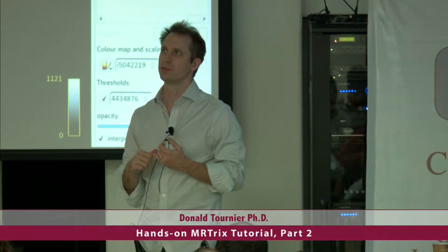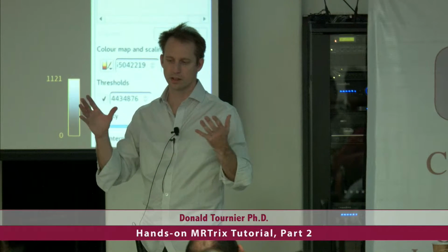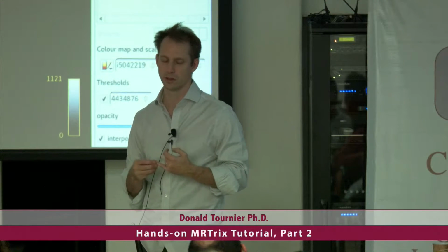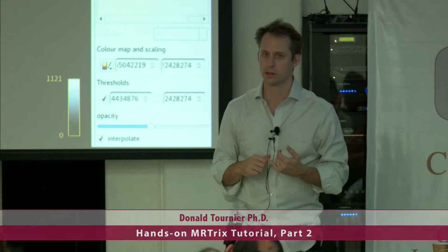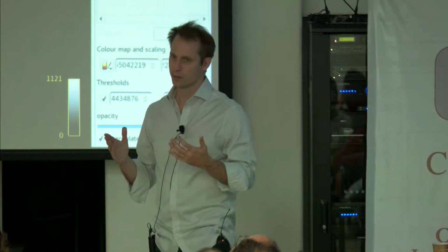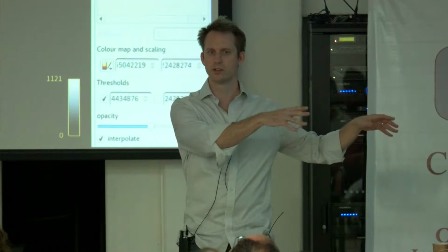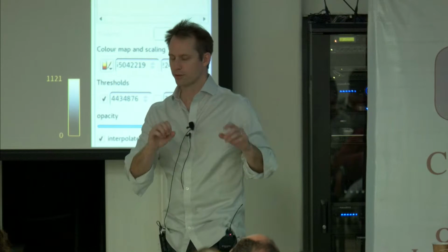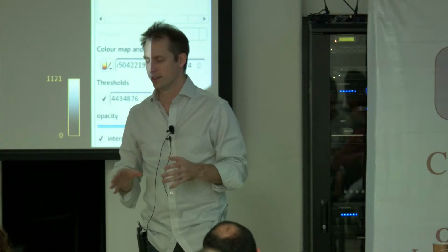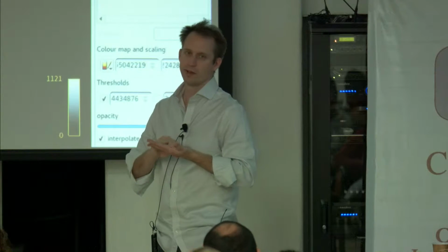Remarkably, I was a bit surprised, but there's this thing on Windows called MSys2, which tries to be like a Unix environment on Windows, and that's really helpful to get things going, but it can be fiddly to set up. Once it's set up, though, it works just fine. So I've got it running on my little Windows netbook. It's a really, really crap little laptop. It took 4 hours to compile MRtrix, but it ran. So that's fine. A lot of people use it on Macs, no problem.